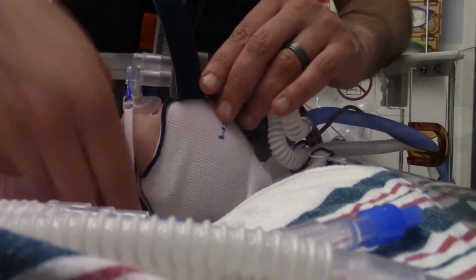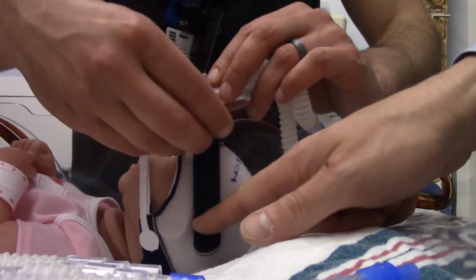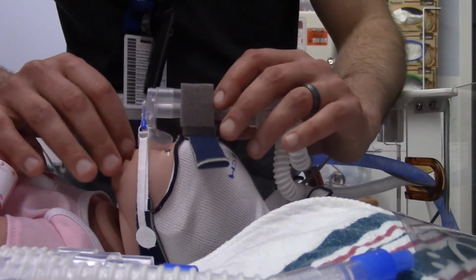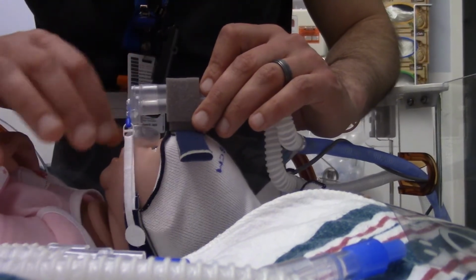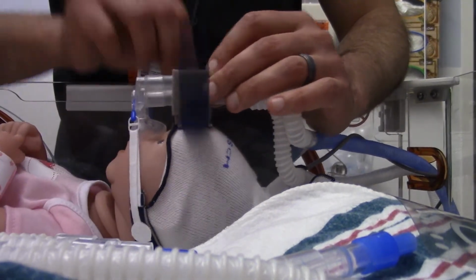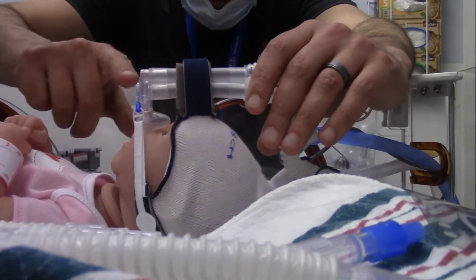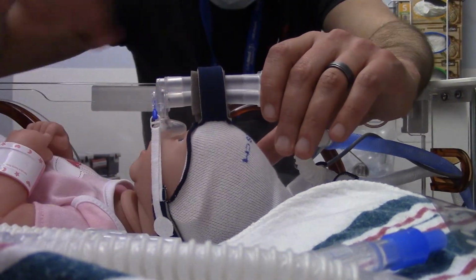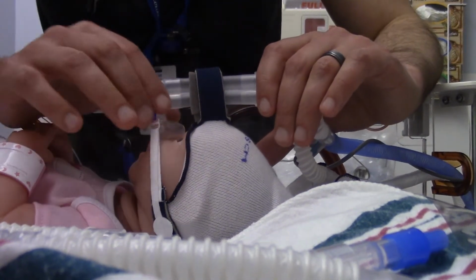is we can start over if need be, come up, take one of these little pads, slide them underneath this, and now the mask is no longer smushed against the baby's nose. We're not going to worry about breakdown or covering up a nare. Nice and easy comes the tab. We can see our trunk is nice and level. Our mask is lightly sitting on top of the child. And we have a sufficient bubble CPAP going. So that is the interface.